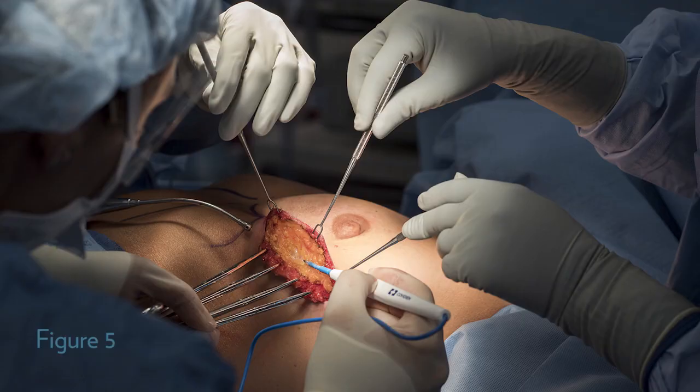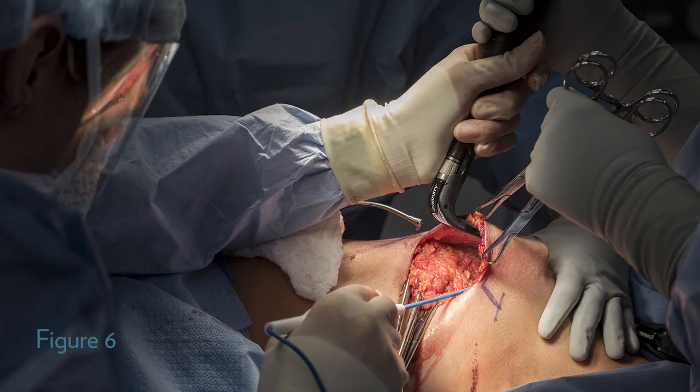I start the creation of the skin flap and I believe this is the most difficult part of the procedure. When you're first starting it can be difficult to get the thickness just right, so I will use skin hooks to elevate the skin and I'll grasp the breast tissue with the Adair clamps and then start to create my skin flaps. It's really important that your assistant provide upward retraction so that you can stay in a good plane and have great visualization. Once I have developed the plane enough then I can start to get in my lighted retractor. Again, it's important to make sure that the assistant is pulling straight up to keep that plane of dissection where you need it. There is also a hand on the chest wall providing upward retraction. With the lighted retractor and my assistant's hand, that really aids my dissection and allows me to get in the right plane and proceed efficiently.